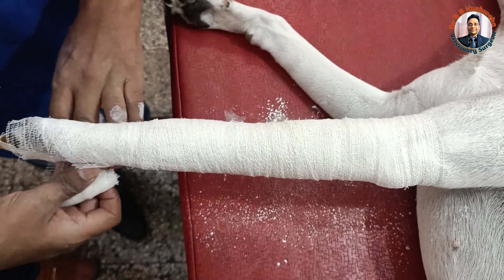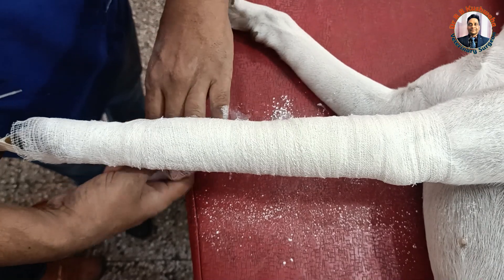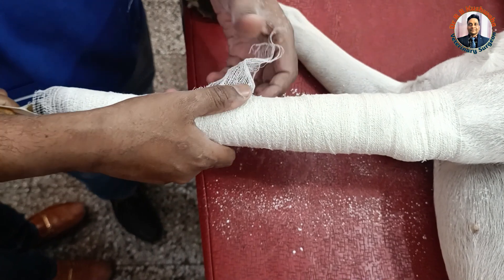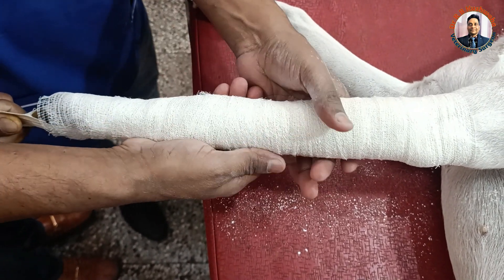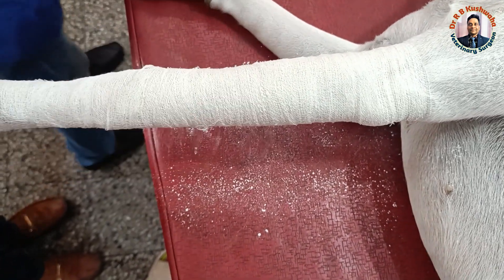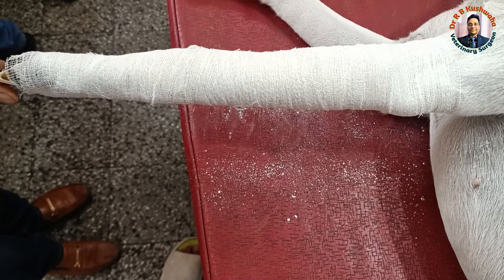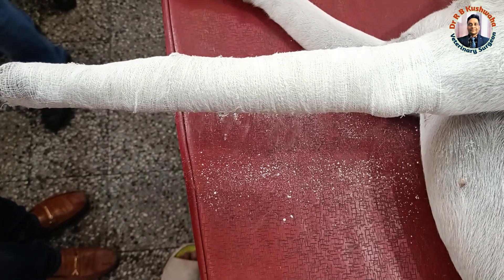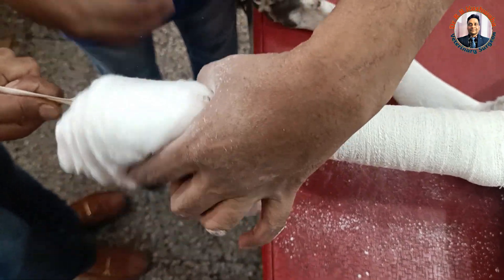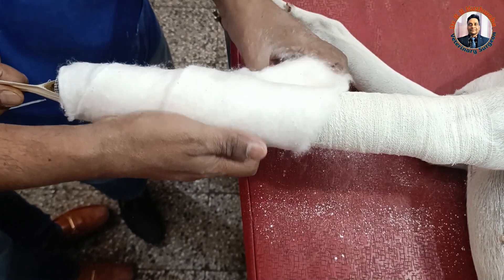Since the fracture is very close to the carpal joint, I am going to apply the synthetic cast, which is the fiberglass cast. There is no need to apply a splint because fiberglass itself provides sufficient strength. Next, we go for the application of the cotton roll, again following the rule of 50.